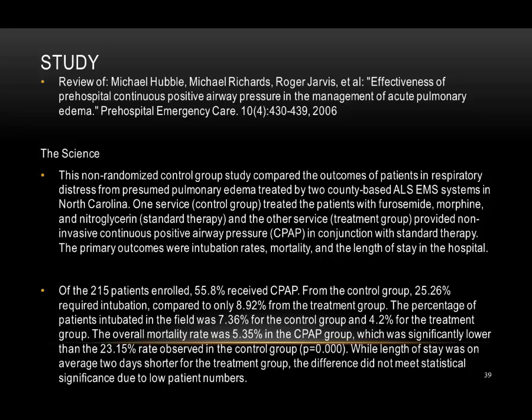We have all been misled by our assessment and heard rales, when in fact the patient had crackles, wheezes, and rhonchi. Another interesting thing about this study is that CPAP patients appear to have been sicker as demonstrated by higher respiratory rates, blood pressures, and subjective complaints of dyspnea. Another difference between these two groups was that the control group was significantly more likely to receive Lasix and morphine, while the CPAP group received significantly greater doses of nitro.